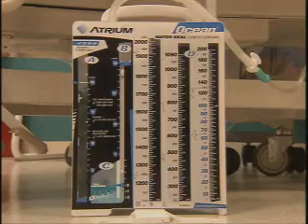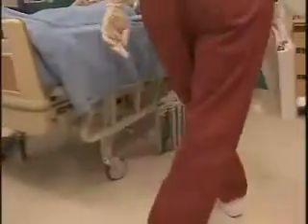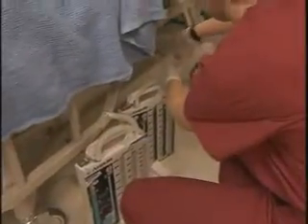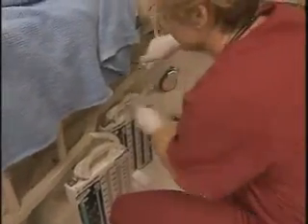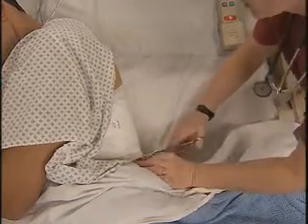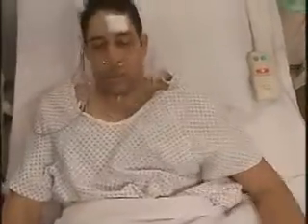When the drainage collection chambers are nearly full, replace the system. To do this, prepare the new system and clamp the chest tube. Then quickly disconnect the old system and reconnect the new one. After unclamping the chest tube, make sure the drainage system is working properly.